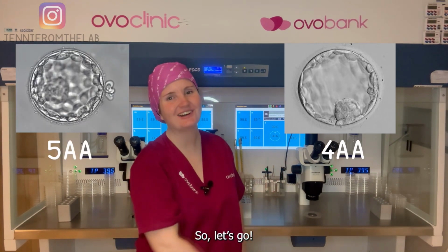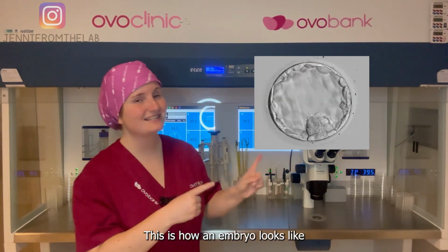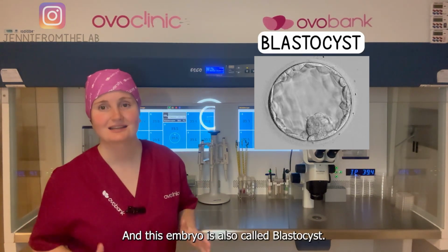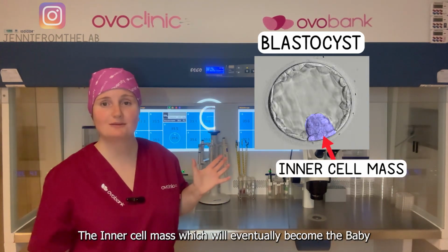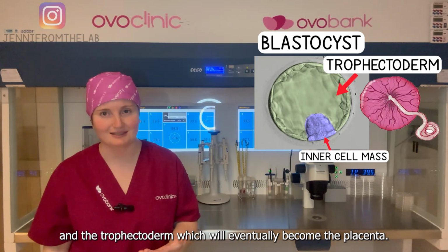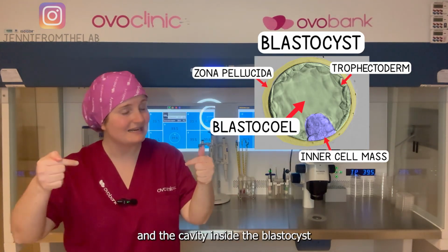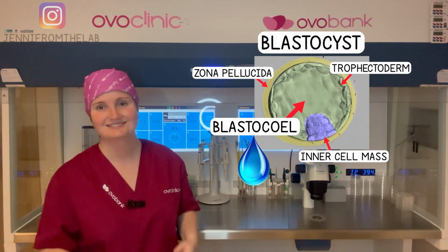So, let's go. We'll first start with the basics. This is how an embryo looks on its day 5 or day 6 of development. And this embryo is also called blastocyst. The blastocyst has two structures: the inner cell mass, which will eventually become the baby, and the trophectoderm, which will eventually become the placenta. The blastocyst also has a shell around it, which is called zona pellucida, and the cavity inside the blastocyst, which is filled with liquid, is called blastocoel.